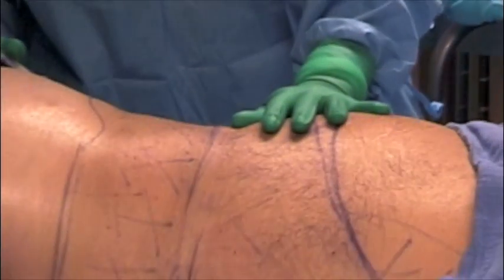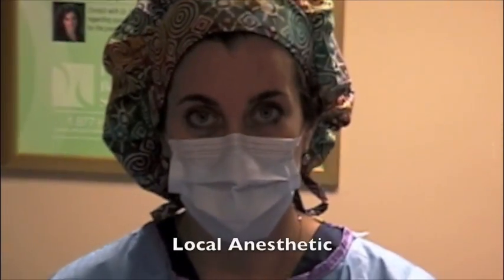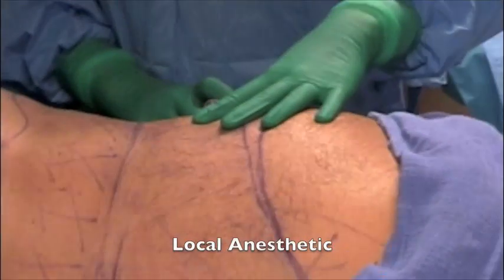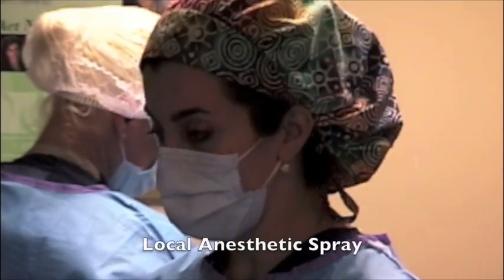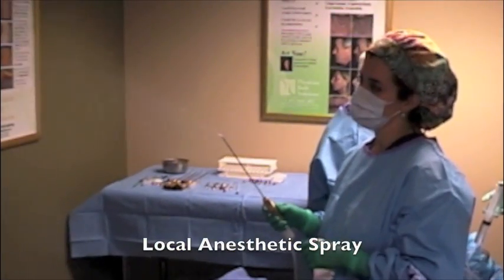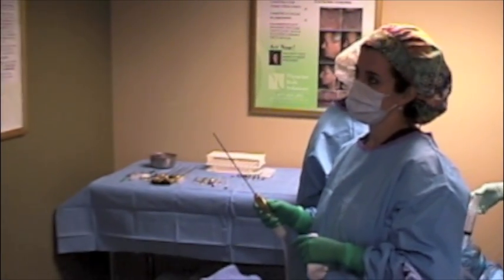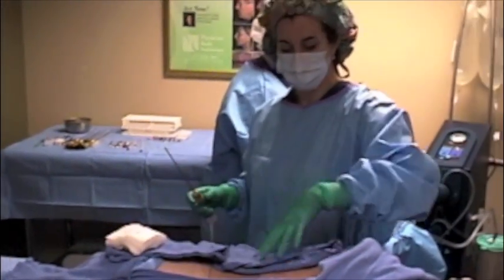This is our patient Phil. We are going to take some fat out of his back and use it for transferring to his nasolabial folds on his face. So first we're going to numb the area. I'm going to numb the area with water jet. And you can see when I push on the pedal, it releases a spray of fluid. That's what's going to be used to numb his back area.